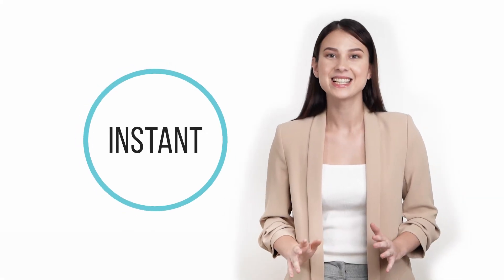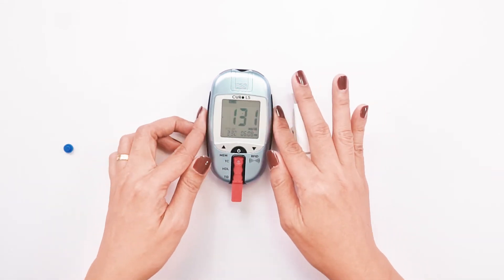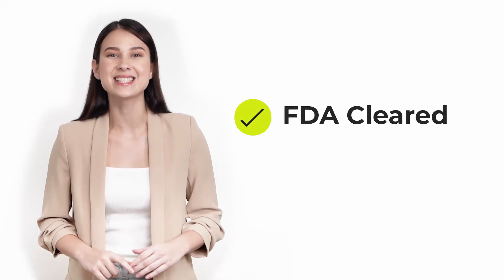It's instant — it quickly encodes results in just two minutes. FDA cleared and CE certified.